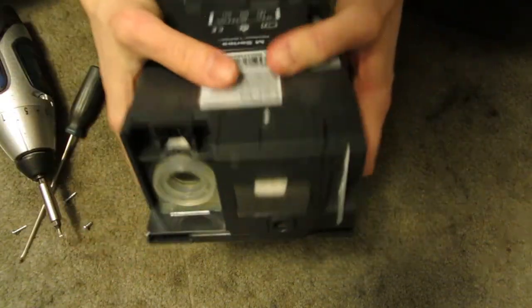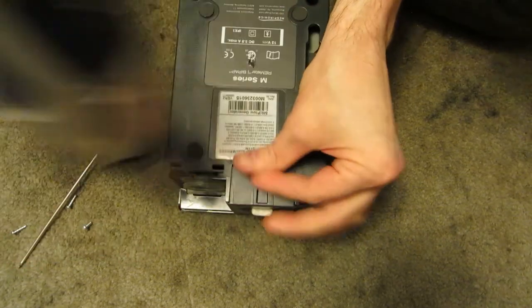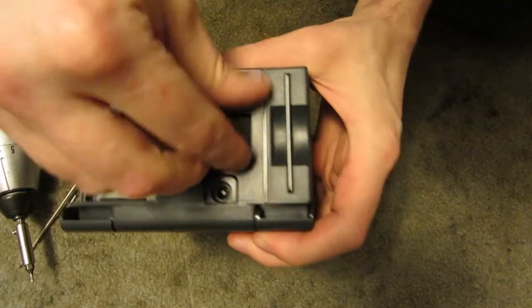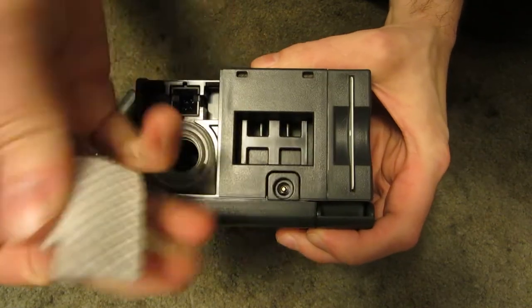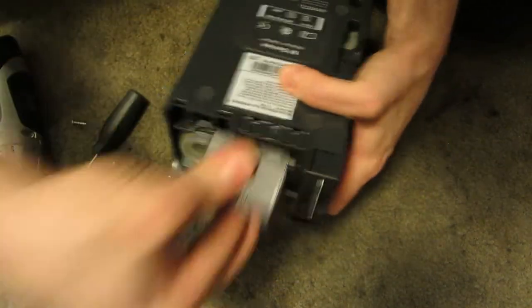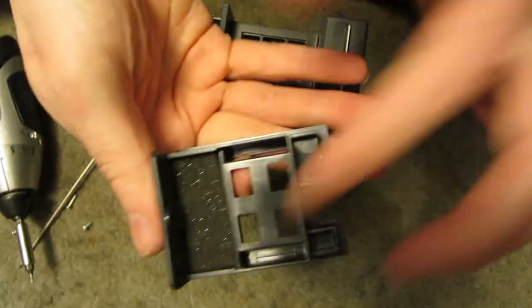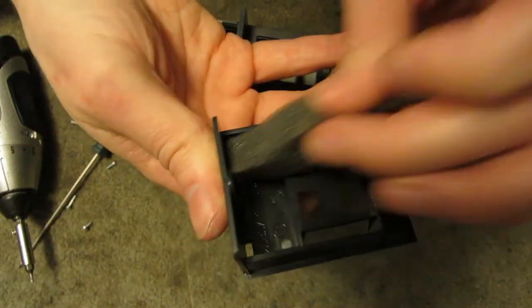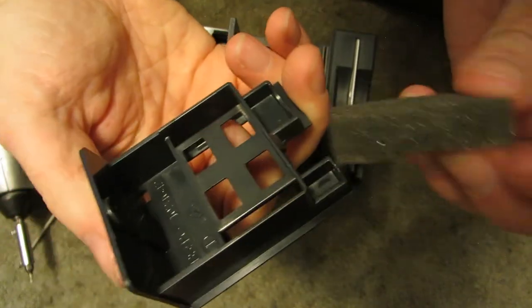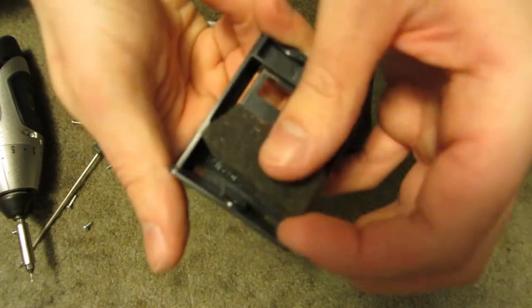Now to get into the mechanical side of it. You've got a little filter — actually, two filters. There's another little filter there, but it's not really in the airstream. I wonder what — I don't know why that's there.